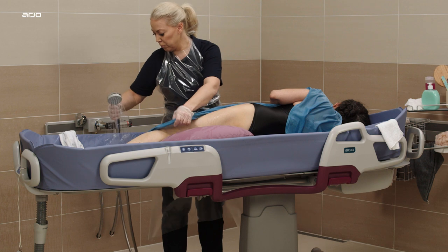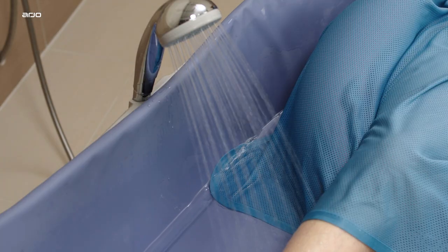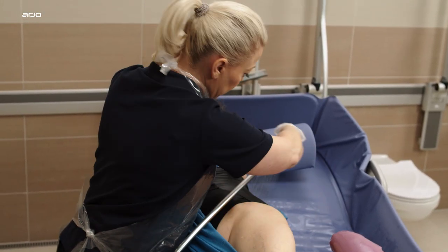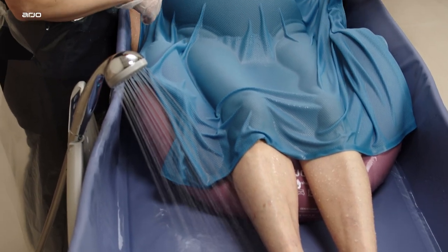The shower handle holder is located on each side support to enable better reach of the shower handle for the caregiver during the shower routine. The shower handle can also be attached there to sprinkle water on the patient or resident to keep them warm.